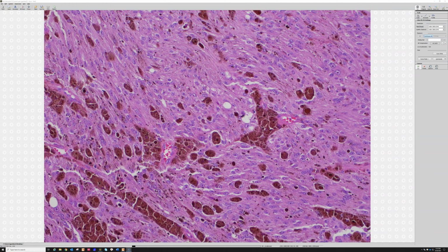So now that we know that and have an easy test for this, it's very helpful that if you're having a debate between malignant melanotic nerve sheath tumor and metastatic melanoma, you can send the test for PRKAR1A to see if the tumor has lost it. Patients with Carney complex can have that loss, but also the majority of the tested cases that have occurred sporadically in patients without Carney also have loss of PRKAR1A.